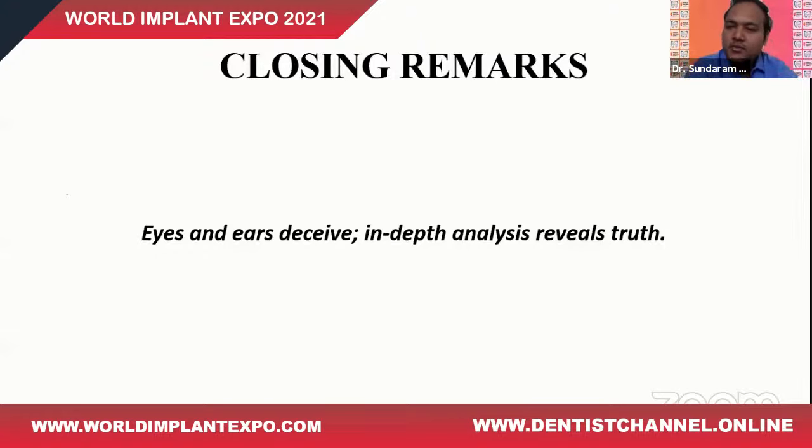The recent introduction of CBCT has completely revolutionized oral maxillofacial radiology and implantology. In spite of the substantial body of literature that has emerged, only very little of it has so far approximated the highest standards of clinical evidence. Therefore, its use, as with any other radiological investigation, needs to be clearly indicated for that particular patient.